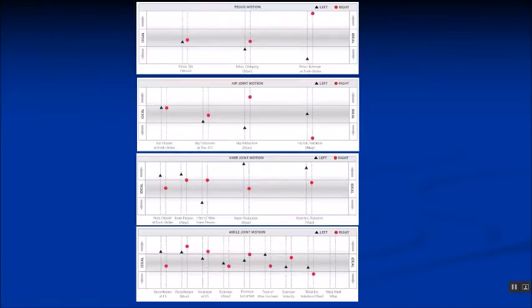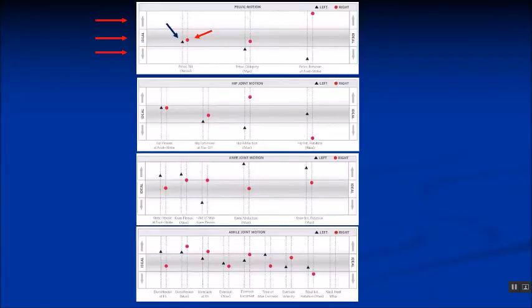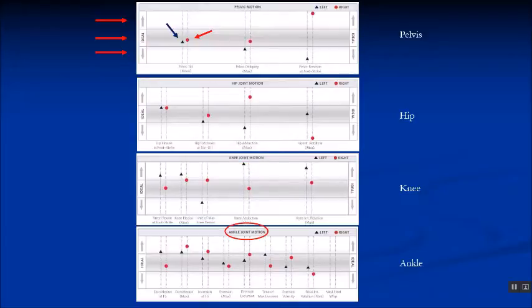When we look at the type of report from the 3D analysis, the blue triangle is the left side and the red circle is the right side. These values are then compared statistically to an uninjured database and plotted plus or minus one standard deviation for the ideal range, with excessive and restricted ranges indicated. This allows us to evaluate motion at the pelvis, hip, knee and ankle.